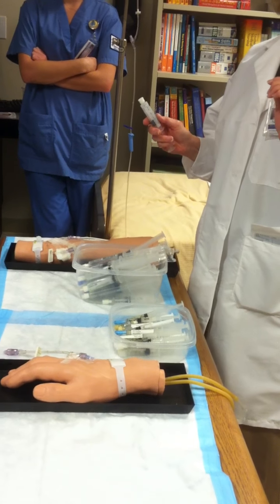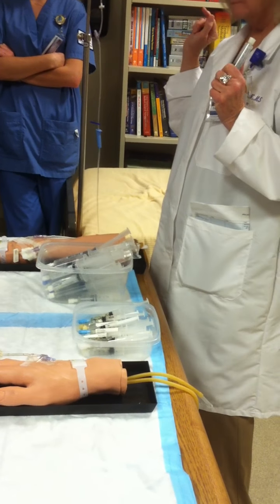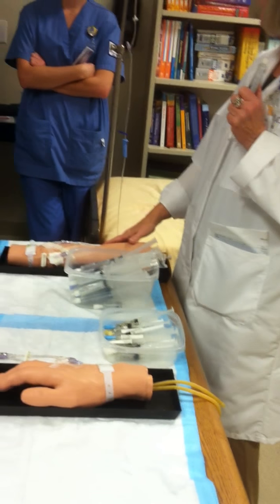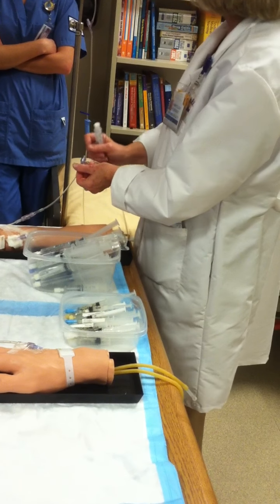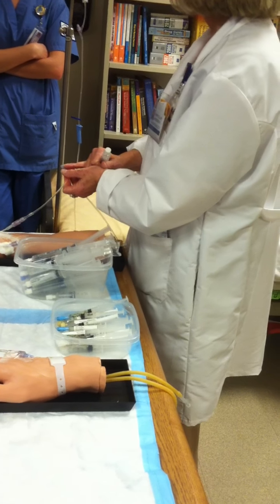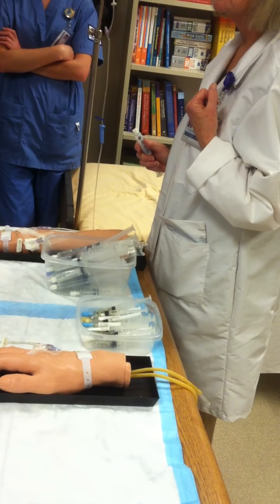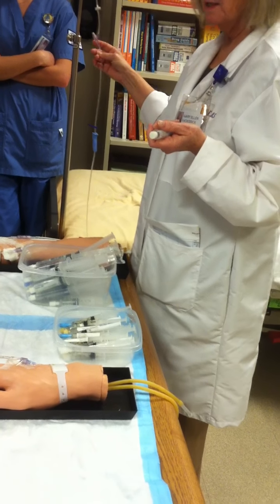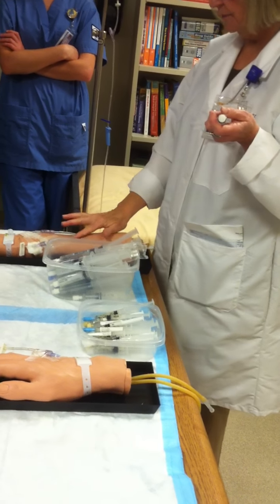Check the IV fluid infusion rate and restart the infusion pump if appropriate. The rest is general: document, evaluate response, and wash your hands. As for the port, you just leave it — you're going to clean it off the next time you do something, and it has a seal on it. You don't need to worry about flushing the tubing as long as your IV has been running okay and there are no signs of infiltration, because when you do the push, that's really what you're looking for — that fluid is going in without any problem.